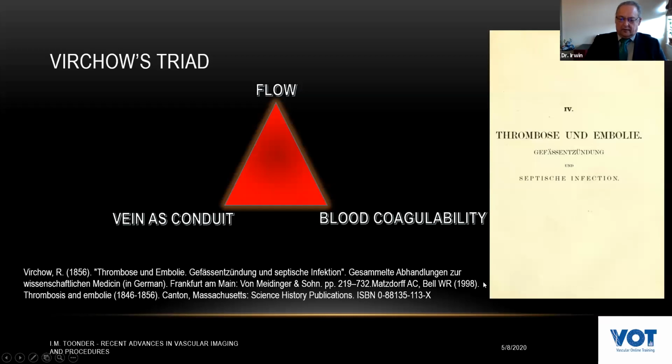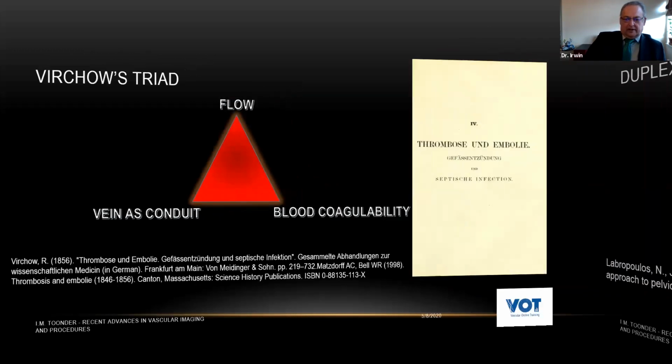This should be mandatory. We should not just depend on supine diagnostics. Of course, with the duplex, we cannot really look at the hypercoagulability of the blood, but this is what we should be looking at. We should be asking, where is this blood going to? Of course, there are limitations to our duplex.